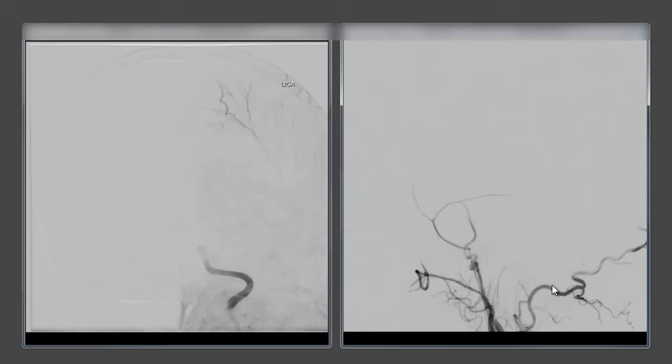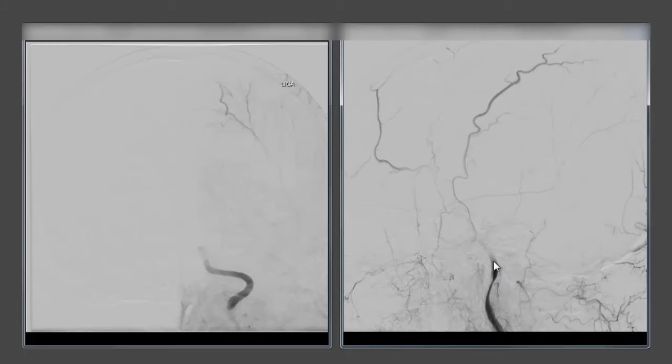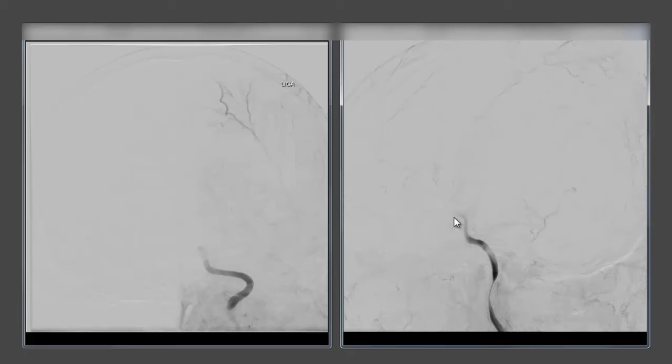Same thing in the side view, contrast opacification of the scalp branches so far we don't see any clear internal carotid artery but now we start to see slow passage of contrast-opacified blood into the internal carotid artery up to or close to the point of the clot at the carotid terminus.